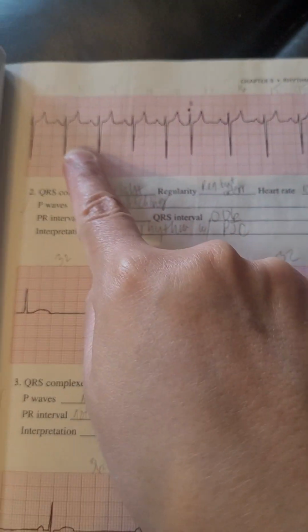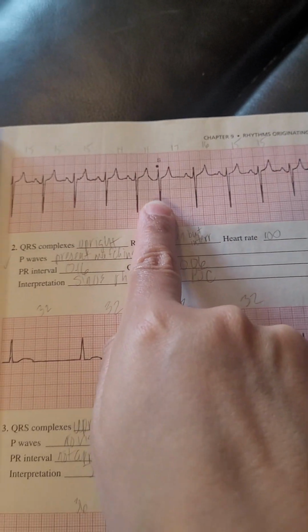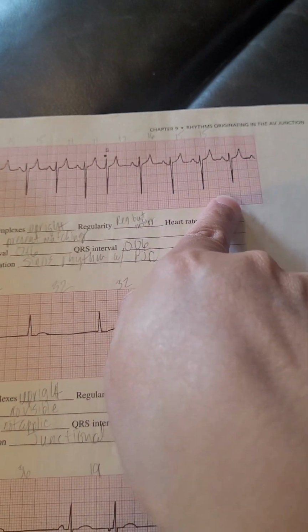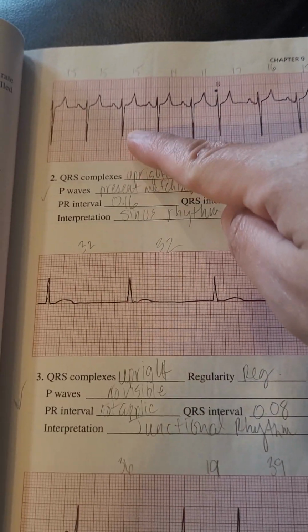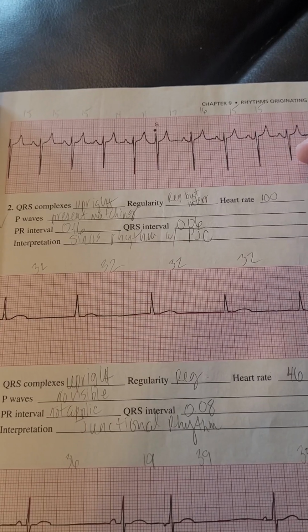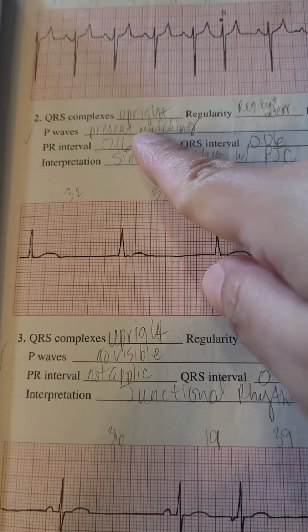So the underlying rhythm would be, let's count 1, 2, 3, 4, 5. We're still going to count this one here, but let's see what it will be at the end. 1, 2, 3, 4, 5, 6, 7, 8, 9, 10, 100. So it's a sinus rhythm because you see a P wave. They're marching now. So the underlying rhythm is sinus rhythm, but it's interrupted by a PJC. Sinus rhythm with a PJC.